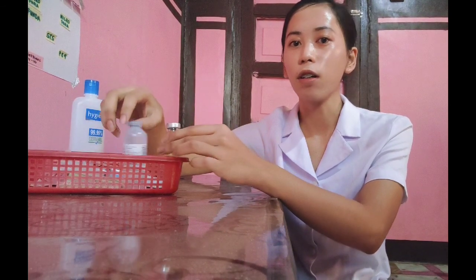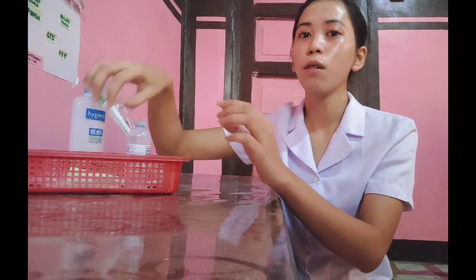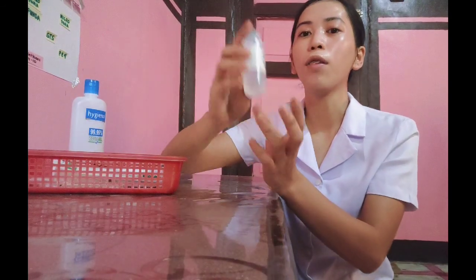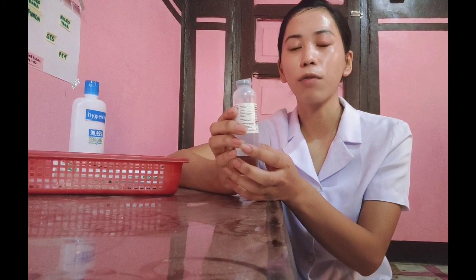Then we have the client's MAR or the medication card. We have also the vial, sterile medication. And then we have also the antiseptic swabs. And we have also syringe, sterile water, or normal saline if drug is in powdered form.